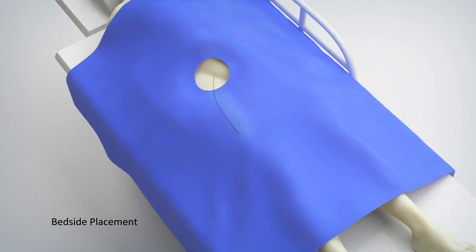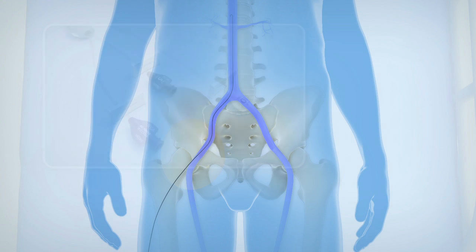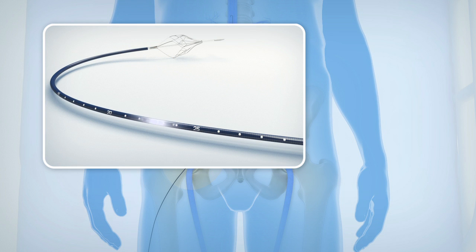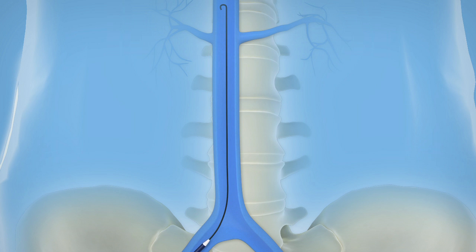Access the femoral vein using the Seldinger technique. Prepare the Angel Catheter for insertion. Flush the three lumens and ensure complete wetting of the external surface of the catheter to activate the hydrophilic coating. Advance the Angel Catheter over the .035 guide wire all the way to the hub.